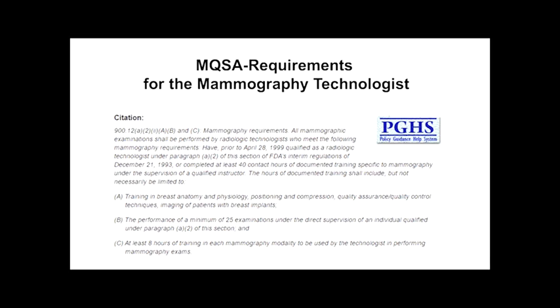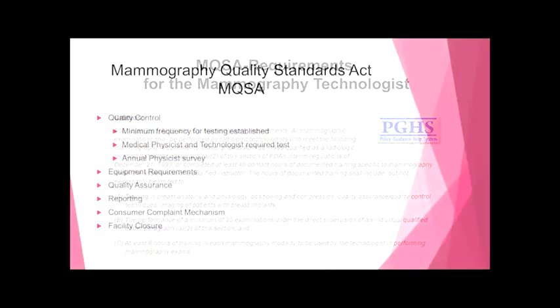At least 8 hours of training in each mammography modality to be used by the technologist in performing exams. That wasn't in the original law, but of course they had to come back. And when they finalized the rules for MQSA in 1999, they had to come back and address some of the new imaging modalities. One of those, of course, was digital.